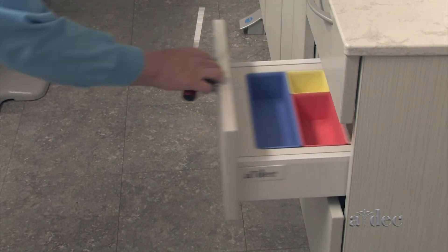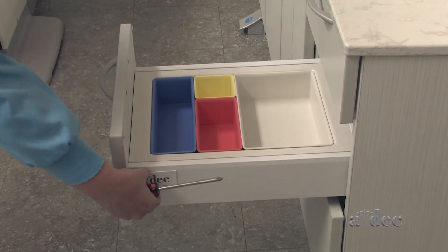To adjust the drawer face alignment, remove the logo cover on both sides of the drawer.